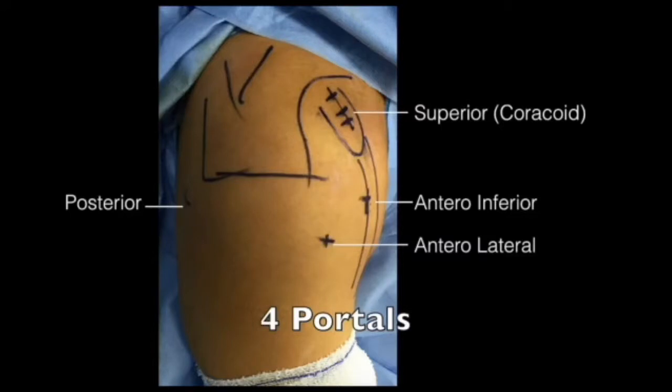To perform the operation, the patient is placed in a semi-beach chair position. Four portals are utilized for this procedure: a standard posterior portal, an anterolateral portal, an anteroinferior portal lateral to the conjoint tendon, and a coracoid portal just above the tip of the coracoid process.